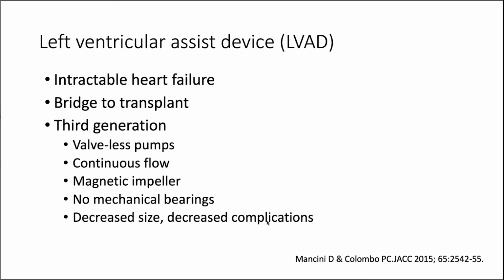Generally, they're used in patients who have intractable heart failure, and they're typically a bridge to transplantation. The current pumps, most recent generation, and I'm sure there'll be additional technical refinements as we go forward, are generally valveless. They typically have continuous flow using a magnetic impeller. They try not to have any mechanical things.